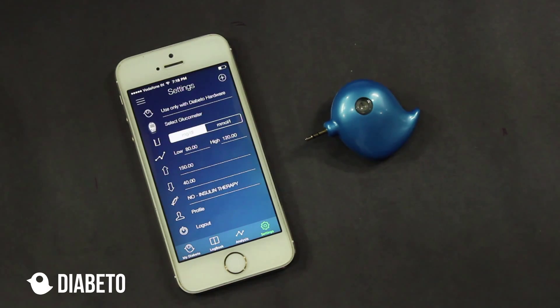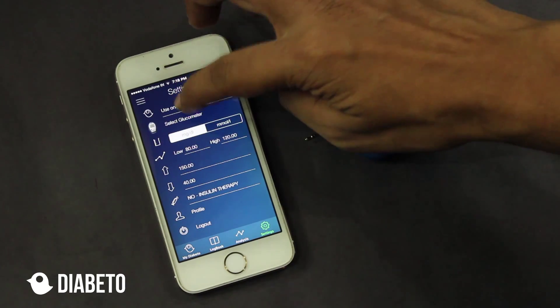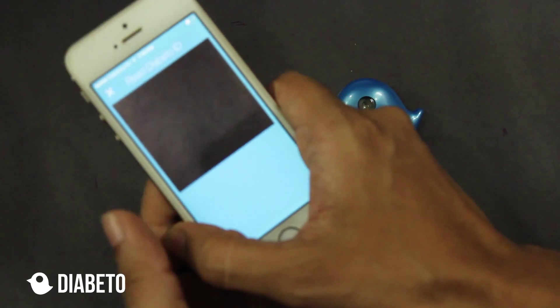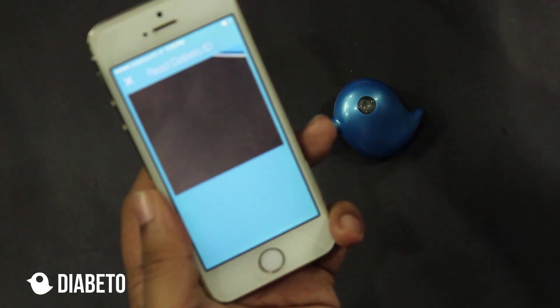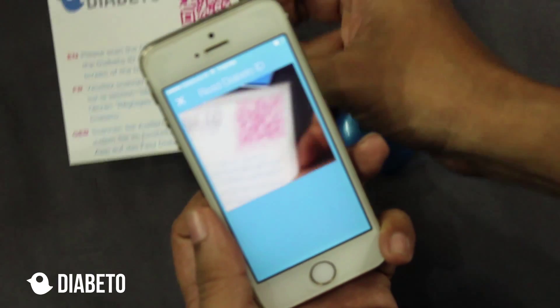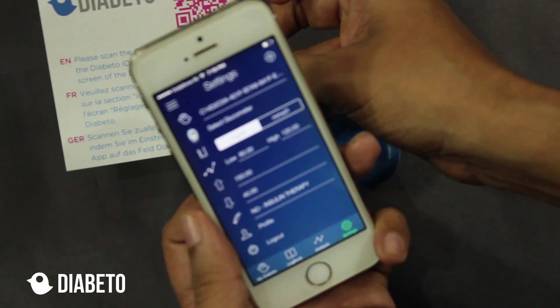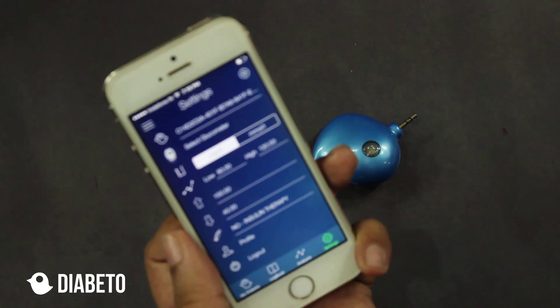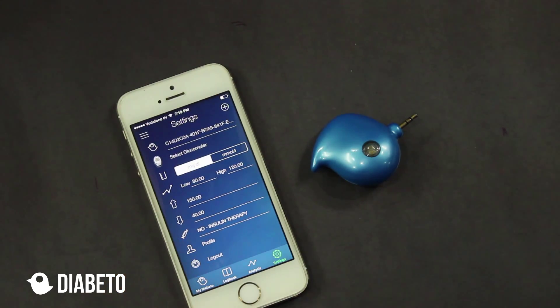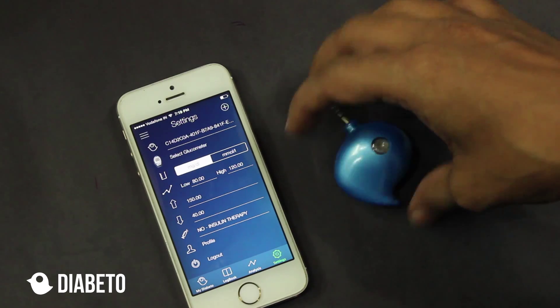Now in the settings screen, the first tab says 'use only with Diabeto hardware.' This is where I have to click on it. Once I click on it, your camera will be initiated. I take this piece of paper and scan this QR code. The QR code is scanned — this is the UD ID, a unique ID for Diabeto. And I've got my unique ID.